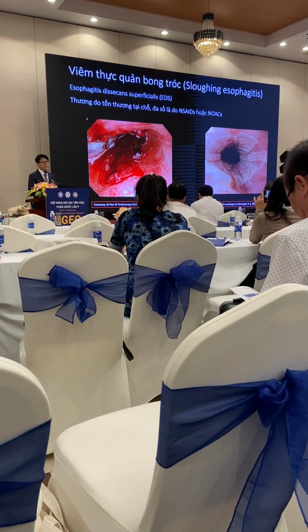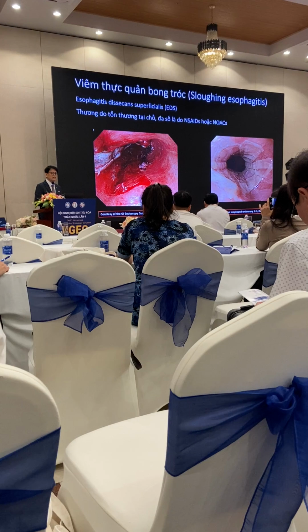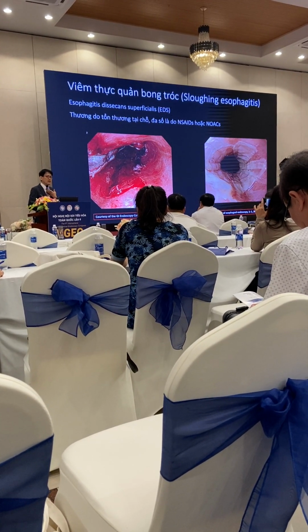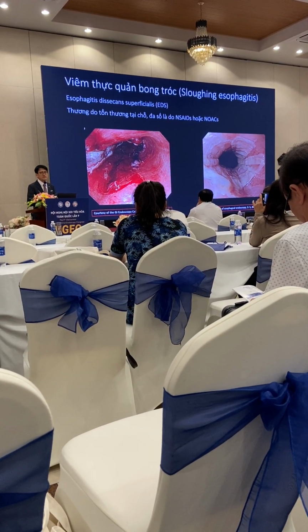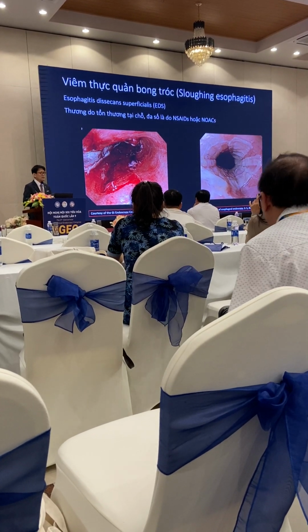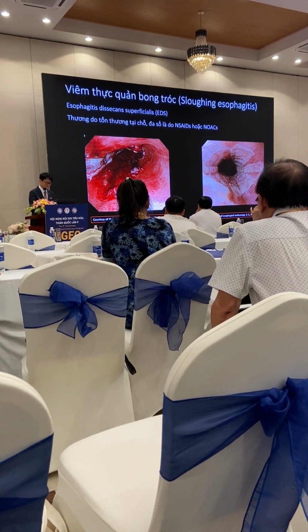This is sloughing esophagitis. Now we have a lot of medicines, NSAIDs and DOACs. After NSAIDs and DOACs, this sloughing happens on the esophagus. Sloughing esophagitis looks serious, but it's easy. Just stop taking the medicine, and then some PPI, wait a couple of weeks, and it is better.